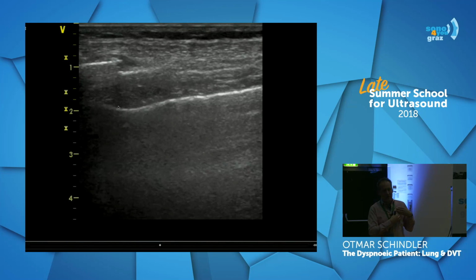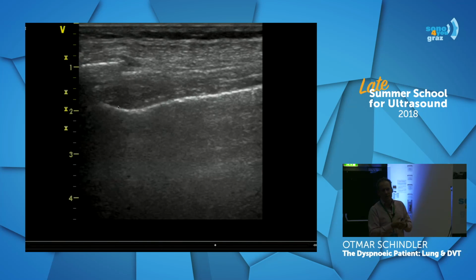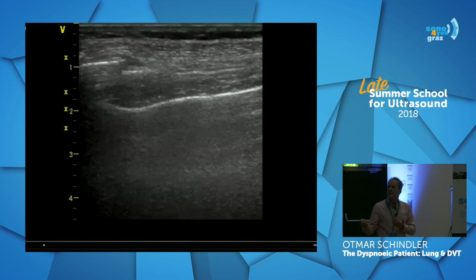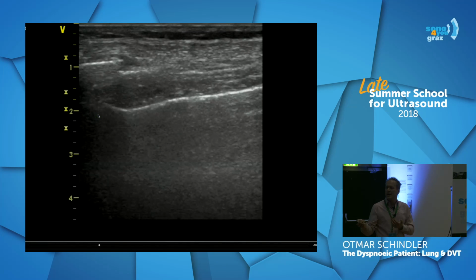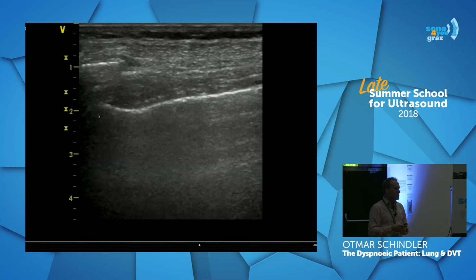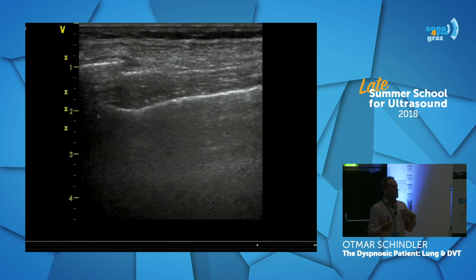The second big fear is what Aidan mentioned. The lung can have a contusion. Lung can be bleeding. There could also be hemothorax or something. But in fact, you just see you can exclude the pneumothorax at that point, and you see the rib fracture. You have your diagnosis. So if there's a rib broken, what is the next thing you do?